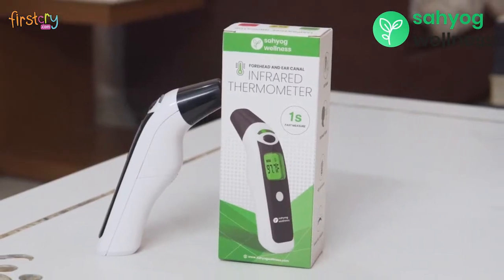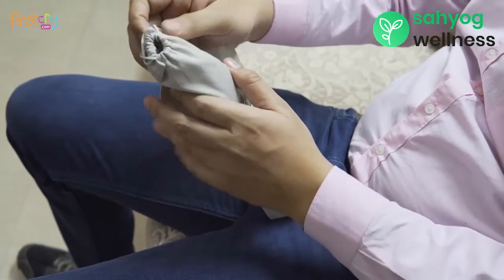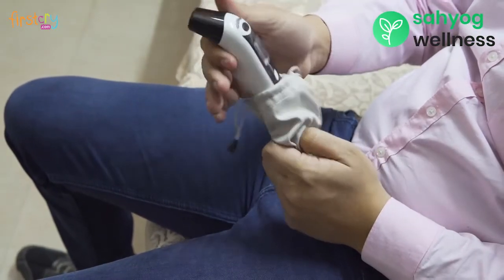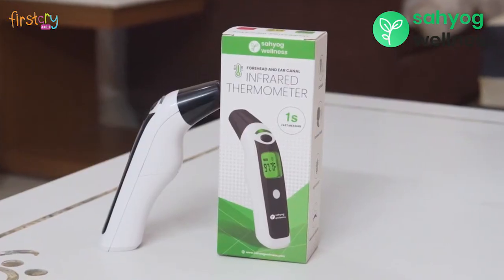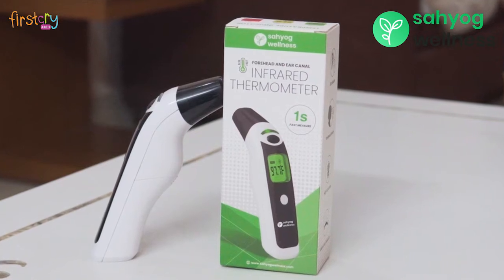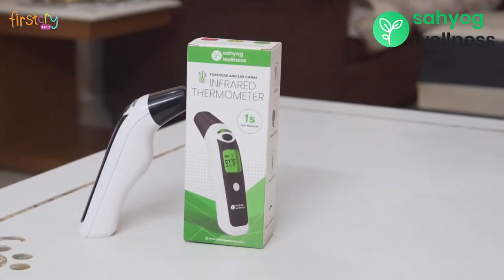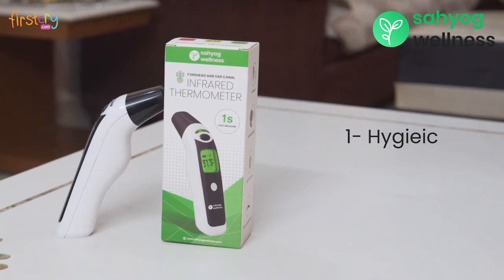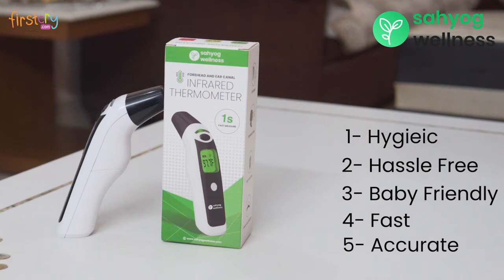Sahihog Wellness Infrared Ear and Forehead Thermometer. Everyone suffers from fever at some stage or the other, and temperature monitoring becomes important in such circumstances. Conventional thermometers relying on oral or contact methods are now obsolete. Infrared technology enables hygienic, hassle-free, baby-friendly, fastest and most accurate results compared to any conventional thermometer.